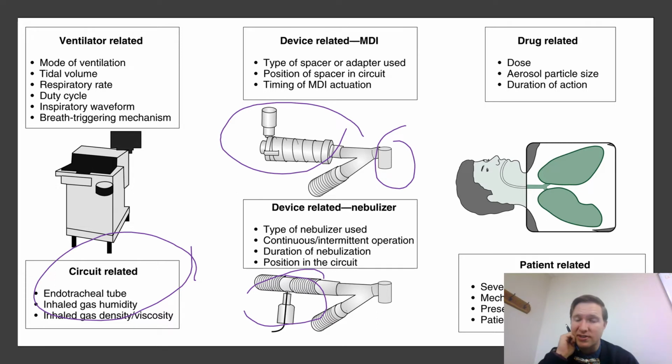So you're breaking the circuit twice, right, with those HME patients. If the humidity is high, what happens to the ability to carry that water, right? It could have the potential to rain out. In other words, some of that medication could be blocked and the patient may not get as much medication. We'll talk about that. There's a little controversy there.